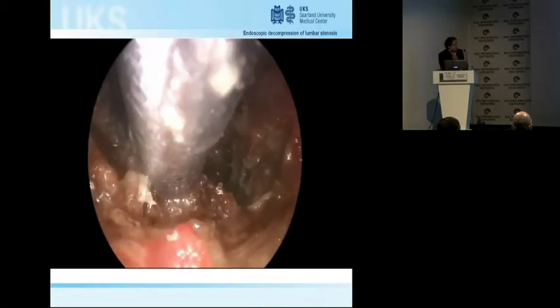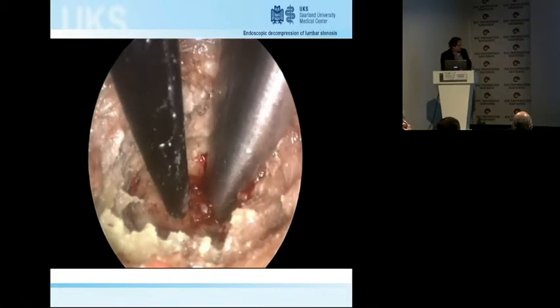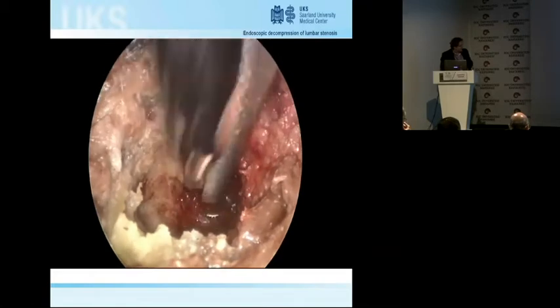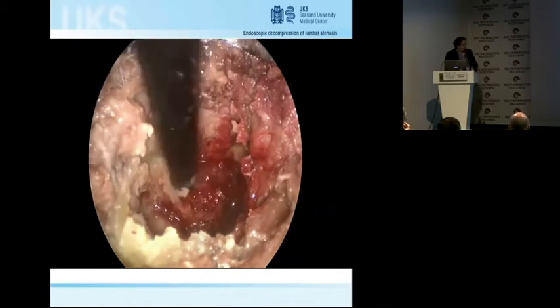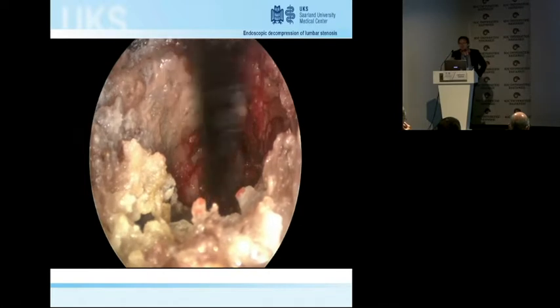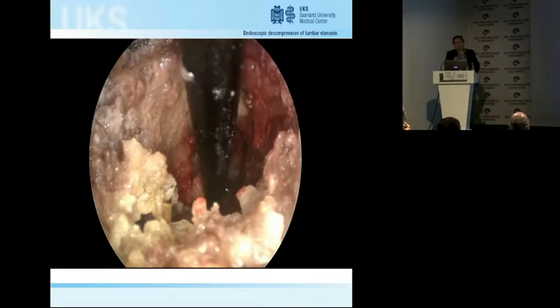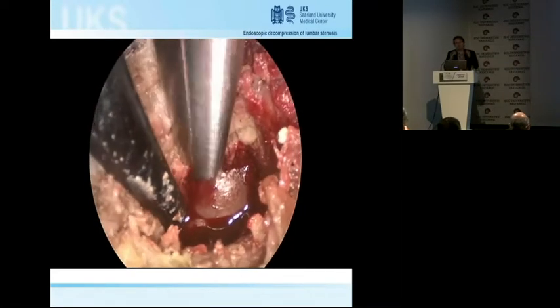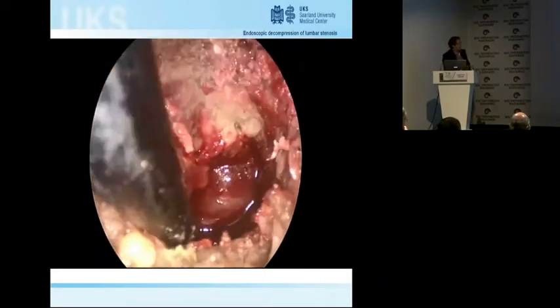This is a unilateral approach, so pretty much what Dr. Koch just told us, but you see the magnification. It's a much more focused approach. You go right medial to the facet joint, and then you go step by step. The difference is that you really have to start in the midline, because in the midline, even if you have very severe central canal stenosis, there's always some remnant space. So you have to start in the midline. Since you do not go, as usual, from the decompressed part to the compressed part, you start in the area of maximum compression right away. So you have to start from the midline and then go lateral.